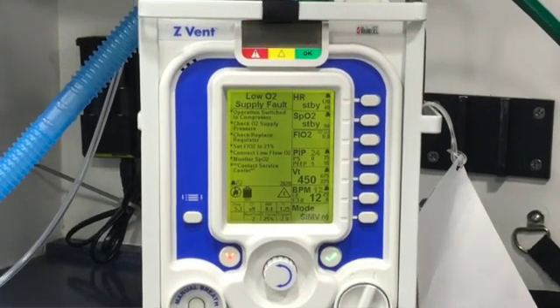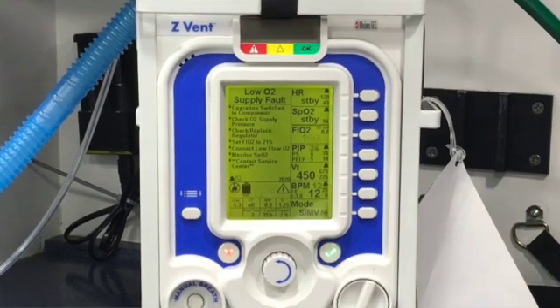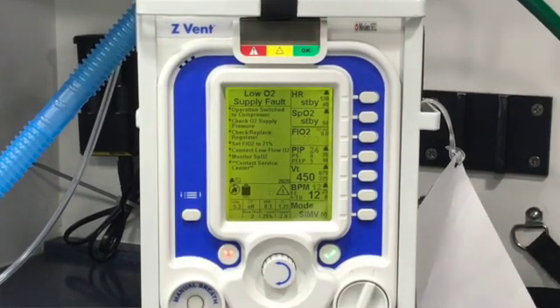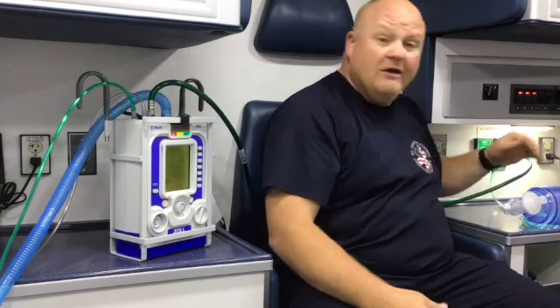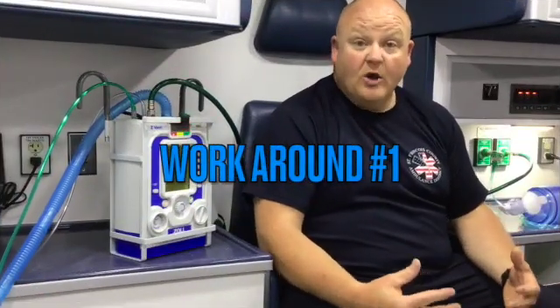You're doing a vent patient, you've got all the vent settings done the way they're supposed to be. You come to the truck and you notice the O2 supply pressure alarm is screaming at you. You've checked your regulator, you know the tank is on, you've got it plugged into the wall, but it's still screaming. That indicates a low air pressure to the high pressure line. Here's the workaround for that.